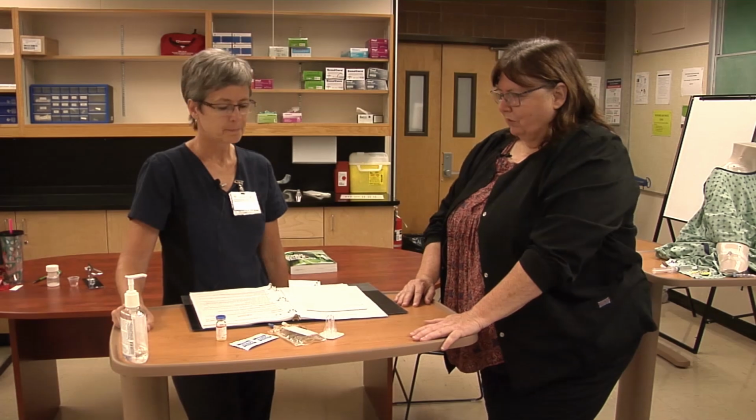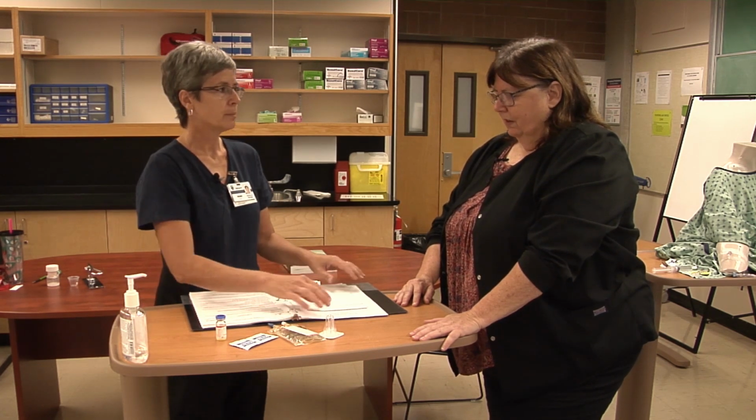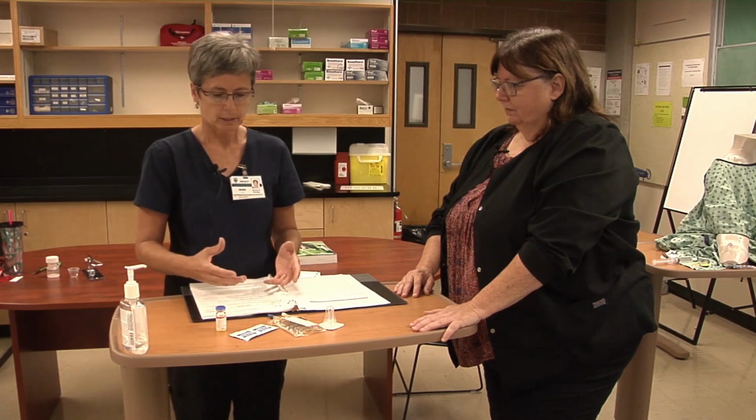Hi Renee. Hi Wendy. So what are we doing today? So let's show students how to reconstitute a powdered IV medication. Okay, so you've checked your MAR, you know what drug you're giving, what dose, what time, to what patient, all those rights. You've gone to your medication dispensing system, you've taken it out per all those protocols, and you've collected your equipment. So you can do this a couple of different ways.